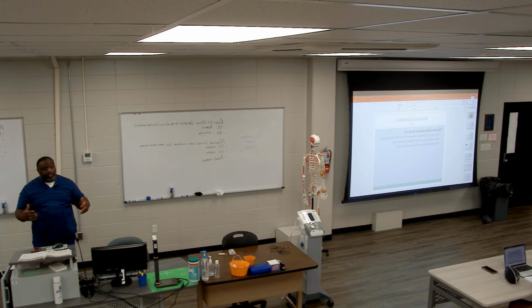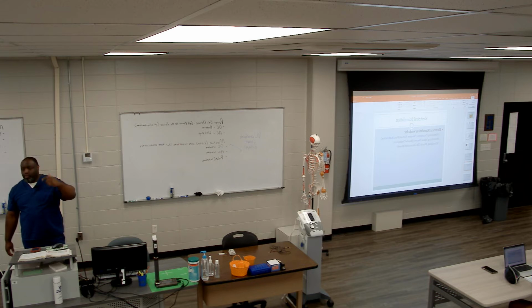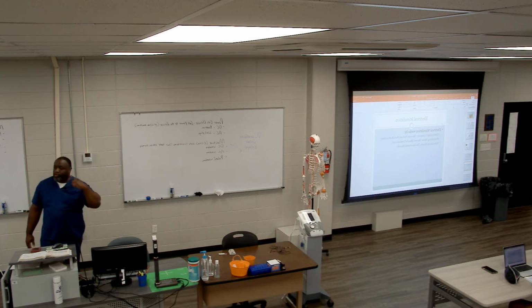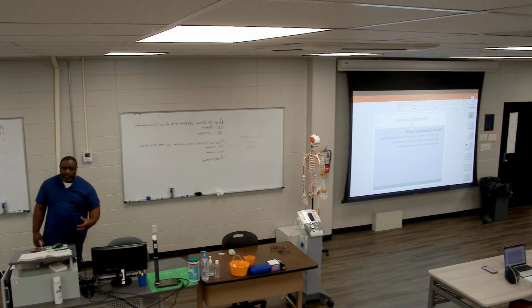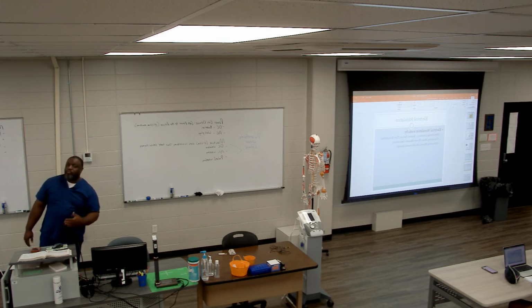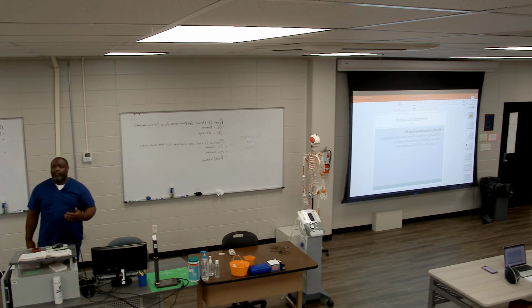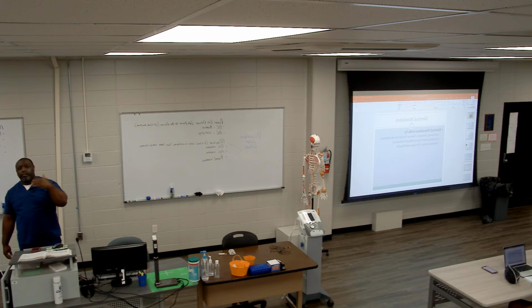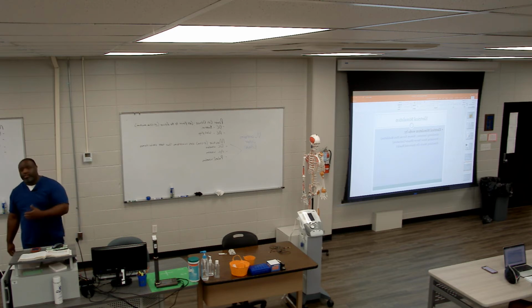And we want muscle contraction for a lot of different reasons, and we'll go into some of those. Some of those are neural reinnervation, meaning we're trying to get the brain communicating with the muscle better. We're trying to stimulate more motor units. Some can be muscle re-education. We can do muscle strengthening. We may need it to prolong muscle endurance.